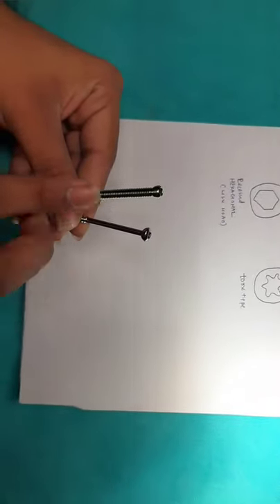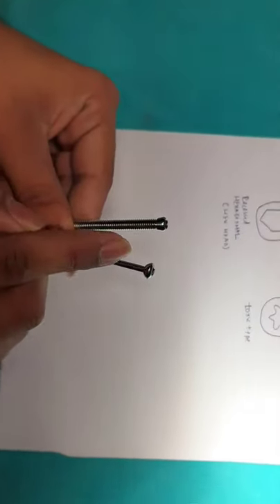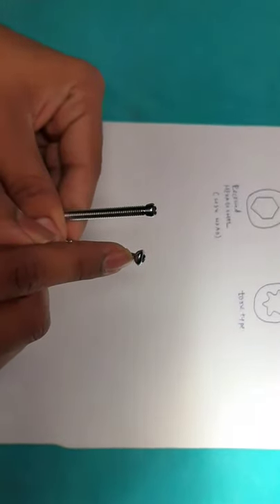Screw heads have two types: this is a threaded head and this is a simple head. The threaded heads are locking screws and this is the simple screw.